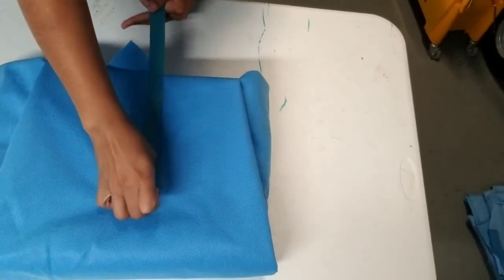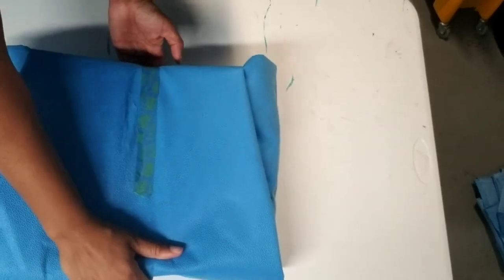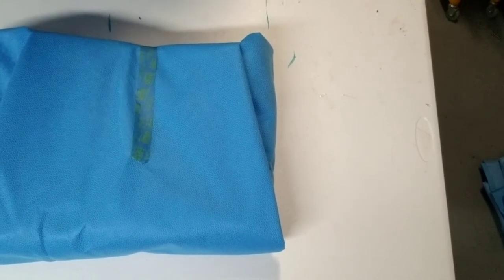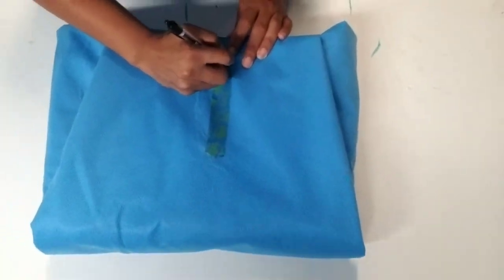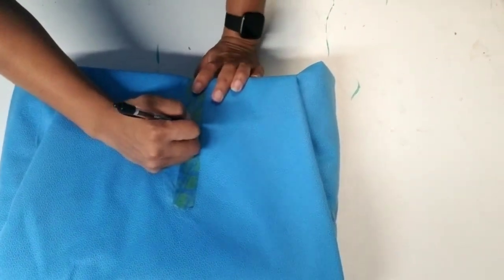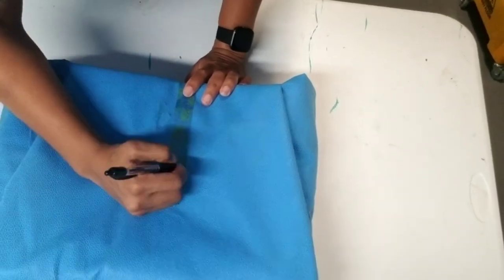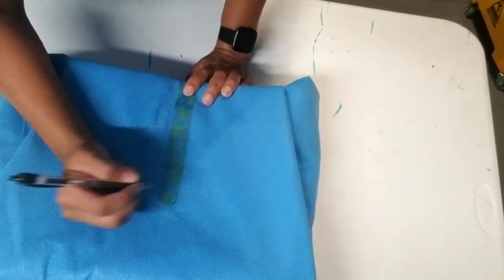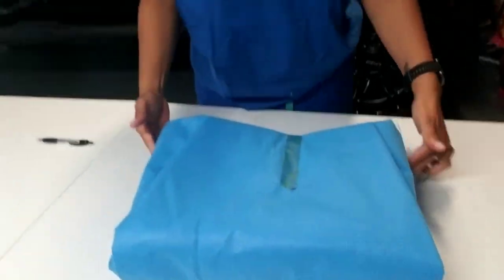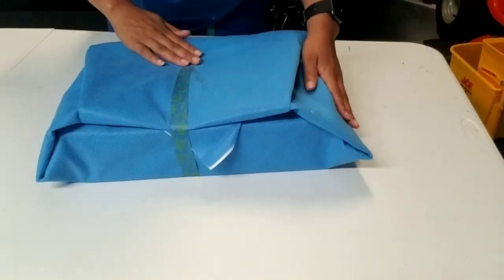Place tape partially over the tab — not all the way. This tape is longer so it will go to the bottom. Label it: today's date, the date it was sterilized, what it is (this is a minor tray), and the initials of the person who wrapped it. And as you can see, it is a perfect envelope wrap.